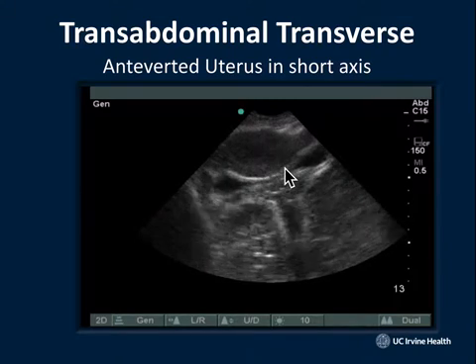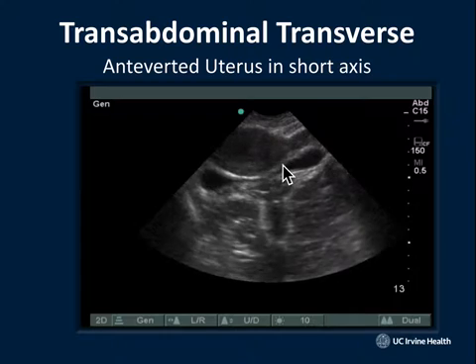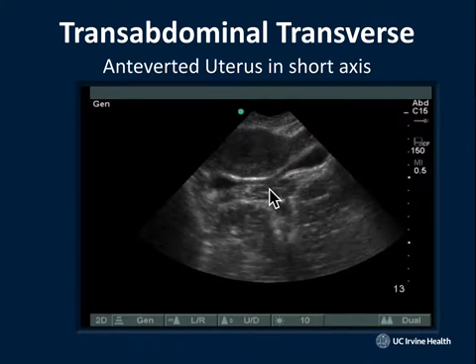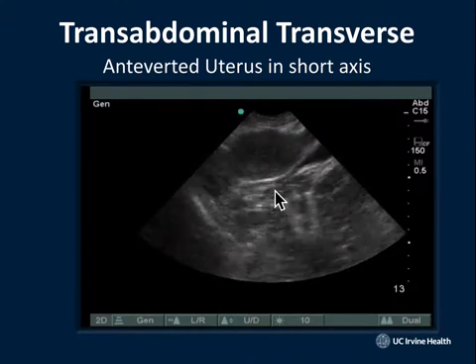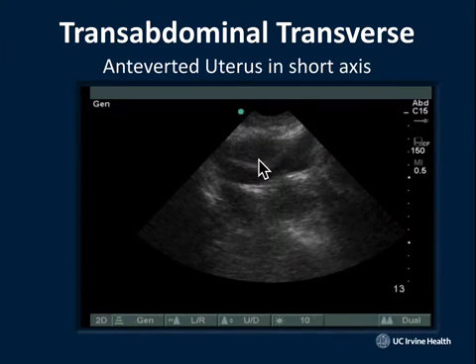And as this clip plays, I don't know if you can get a feel for that or not, but here's the bladder relatively empty, and the uterus is coming out. The vaginal stripe is down here, and then the uterus is going out behind the screen and then coming back out towards you on top of the bladder.